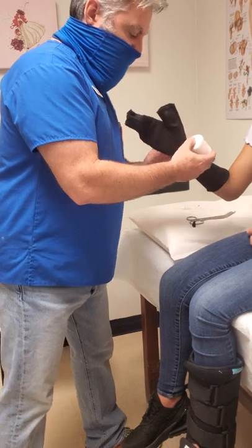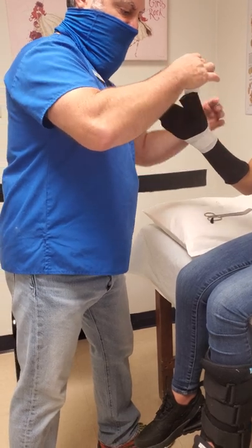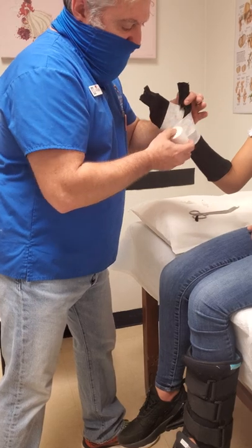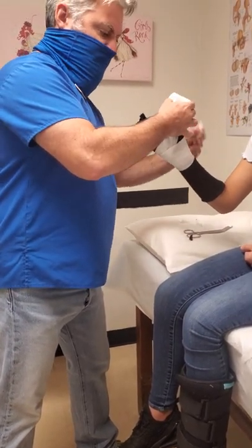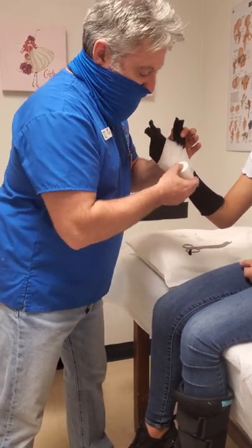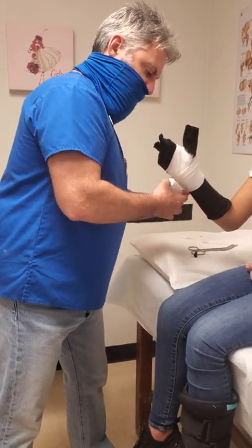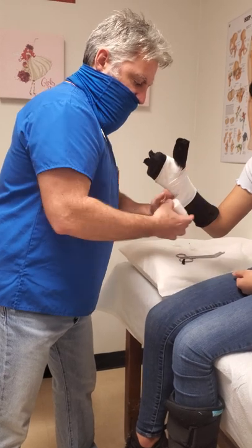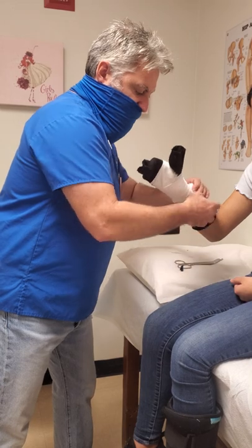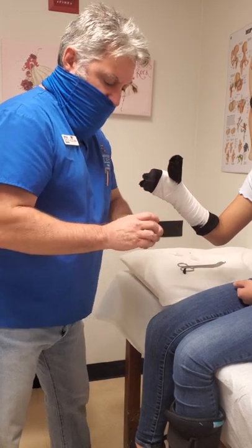Next we're going to apply the cotton, which you've seen in previous videos. We lay the cotton on very comfortably — we do not pull it too tightly because it will shear and break. You don't want it to be too tight on the patient; you want it to fit snug and comfortable so the patient feels secure, but not restricting blood flow or being constrictive. You lay the cotton on halfway over every turn so that it's nice and uniform. Textbook says you should have one to two layers of padding throughout the cast. Stop two to three fingers from the antecubital bend.